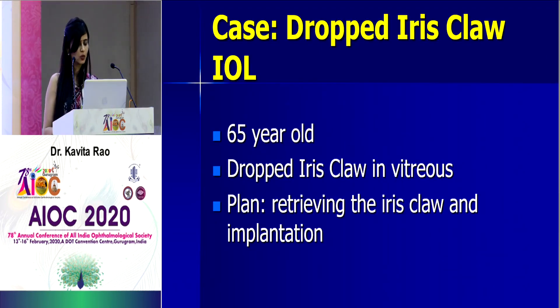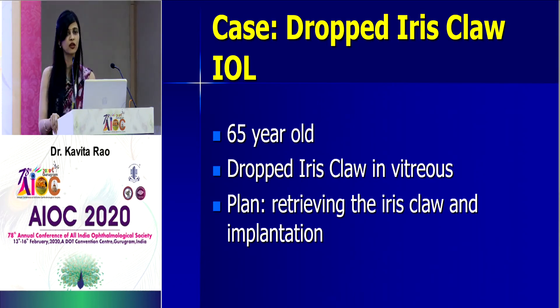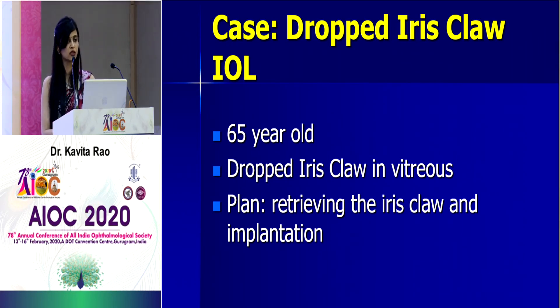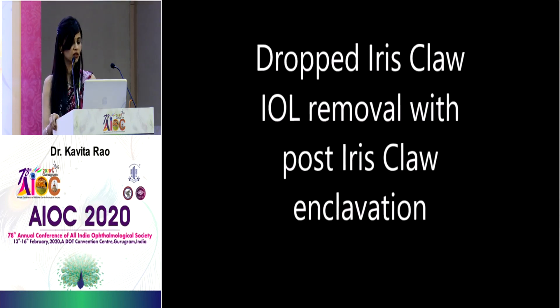The next patient comes to the iris claw. Unfortunately, this is the only iris claw video I have. This was a case where a trainee was trying to fixate the iris claw posteriorly, which is relatively easy once you get the hang of it, but she dropped it into the vitreous. Because the eye was already hypotensive, the retina surgeon retrieved it, and we then enclaved the same iris claw in the eye.